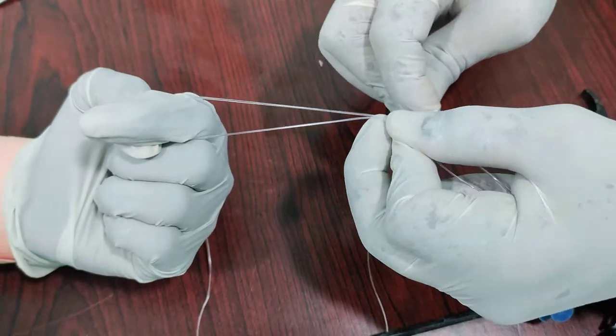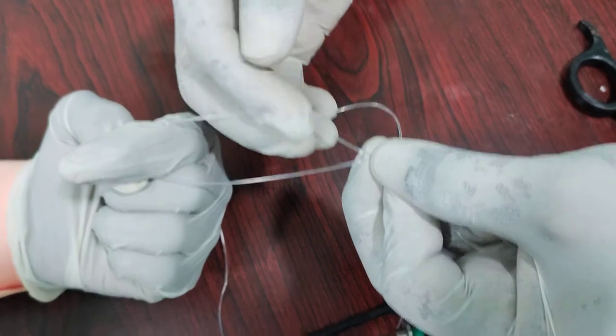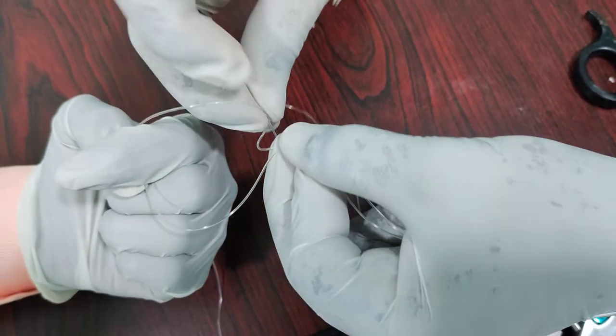Finally, two half knots from this right limb. Okay.